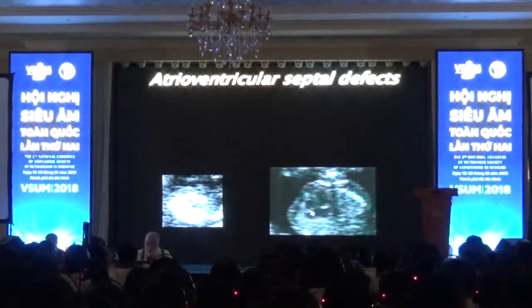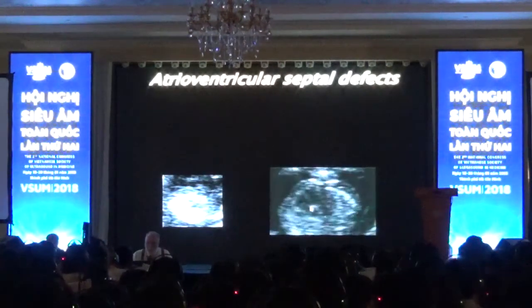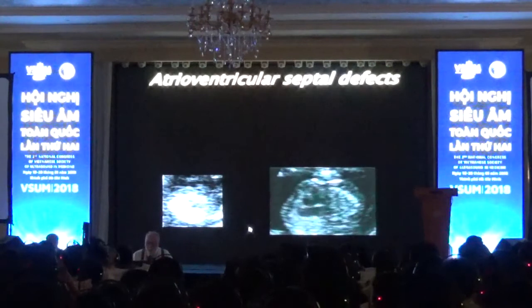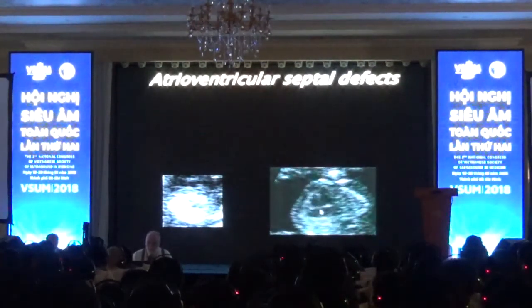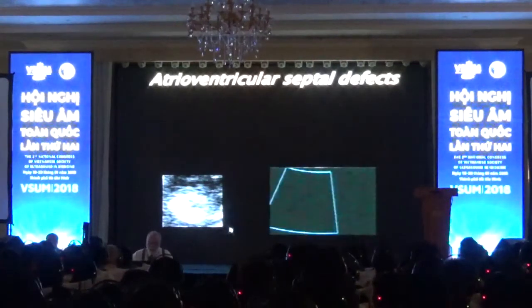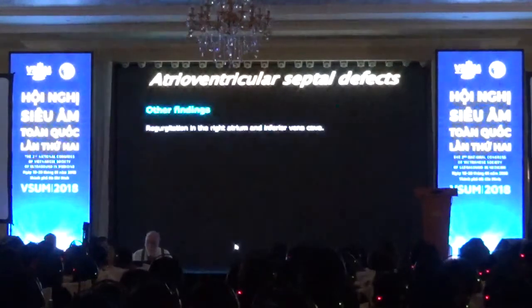You do transvaginal, and you can see the interruption of the interventricular septum and the bridging AV valve over the two ventricles. So you've made the diagnosis of atrioventricular septal defect. It's a first trimester baby. This baby has trisomy 21 until proven otherwise.